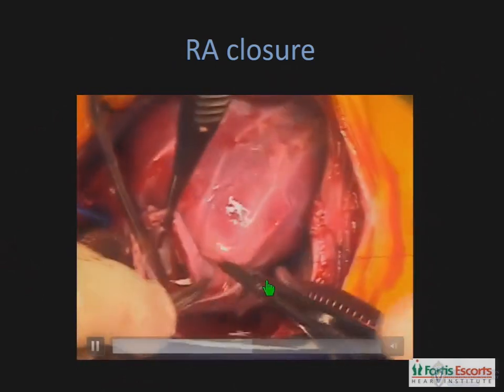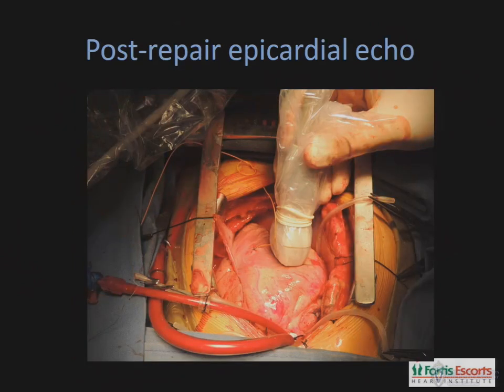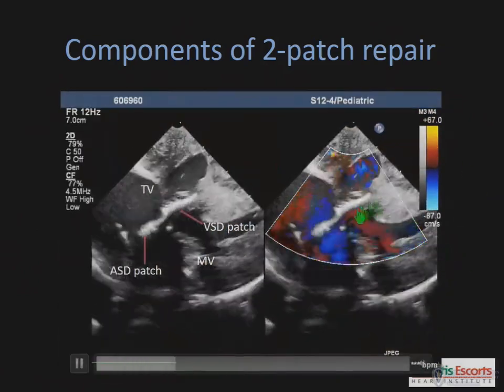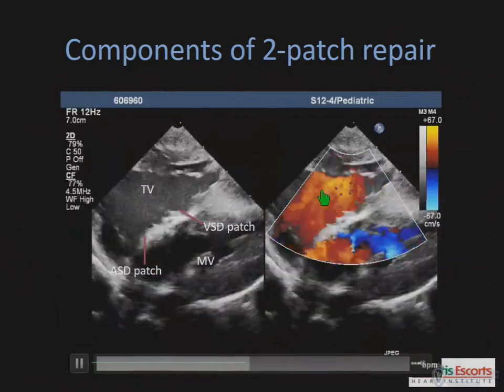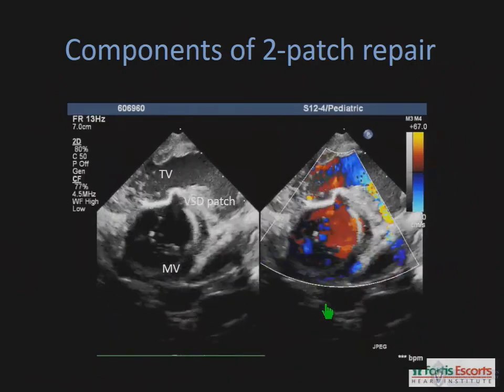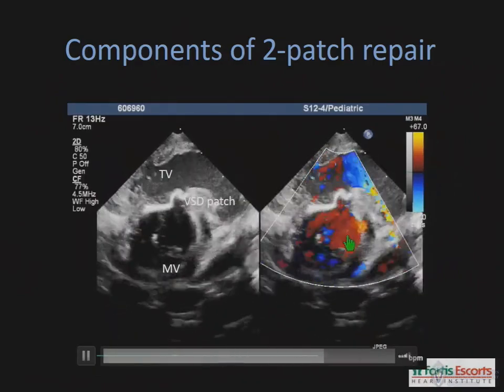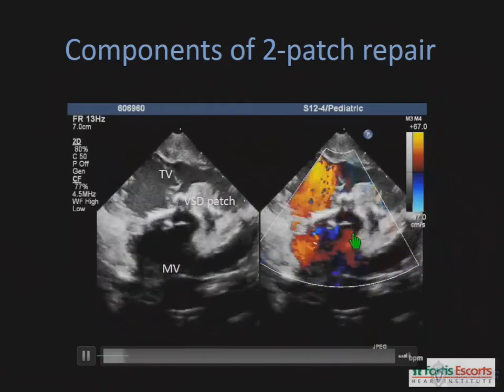Closure of the right atriotomy completes the procedure. At the end of every procedure, our practice is to do an epicardial echocardiogram. Here's an epicardial echocardiogram which shows good repair — that's the VSD patch, that's the ASD patch — competent mitral and tricuspid valves with good flow across them showing no evidence of stenosis. This is a short axis view again showing the VSD patch septating the mitral component and the tricuspid component with good function on both valves.